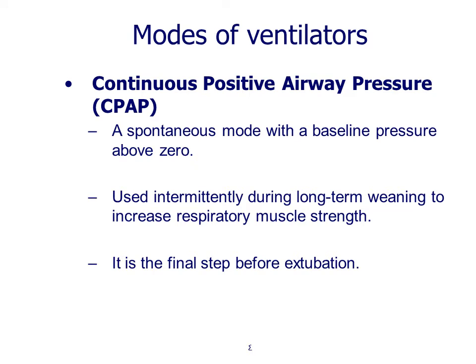CPAP, which is the continuous positive airway pressure, providing positive pressure to prevent alveolar collapse, and also used for the weaning process to increase the respiratory muscle strength. It is the final step before extubation.